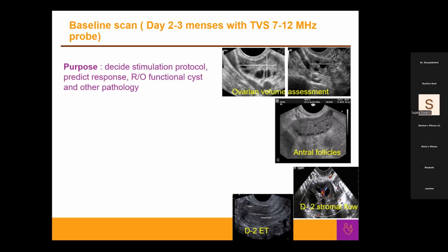There is no point in saying there is no feature of tubal blockage. We cannot suspect or say any tubal pathology because the tube is not visible on ultrasound unless it becomes pathological, visible because of hydrosalpinx or tubal endometriosis or other pathology. A normal tube of normal caliber with a tubal block, we cannot see on the ultrasound. So ultrasound doesn't guide us about tubal patency. For that, we have to make sure of tubal patency, and thereafter it is recommended to start stimulation.